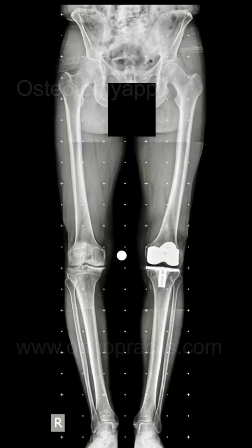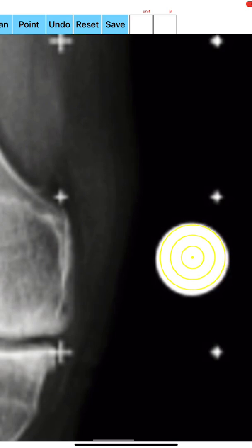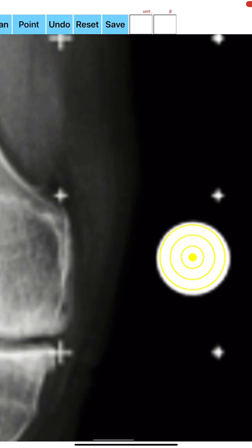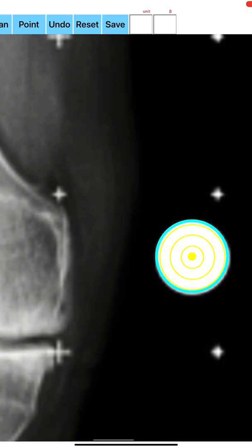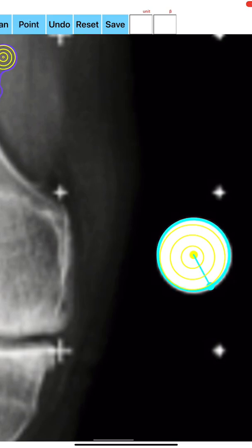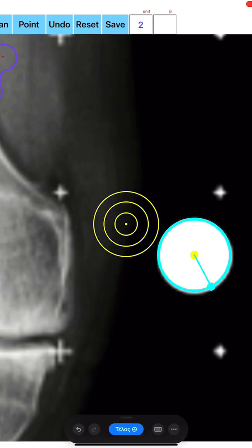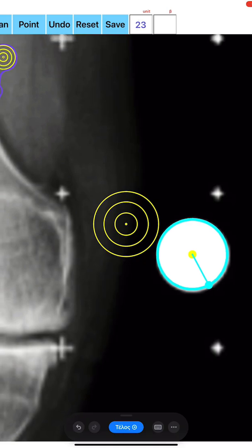To measure, an app weight-bearing whole X-ray of the entire limb is needed. A circular coin of known dimension must be placed adjacent to the patient's body and included in the X-ray. The radius of the circle is dynamically changed as the user's finger moves over the screen. Once the best fit of the dynamic circle over the calibration object is reached, the user presses the point button and the circle is drawn. For a 23mm circular object, a value of 23 is entered in the unit box.